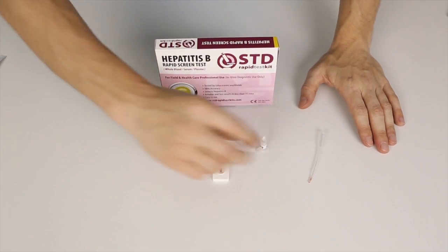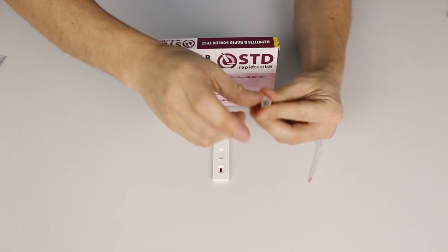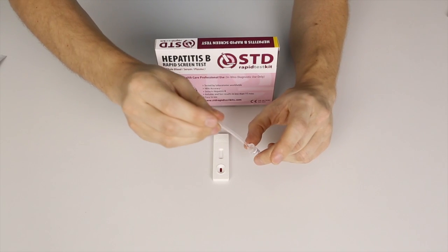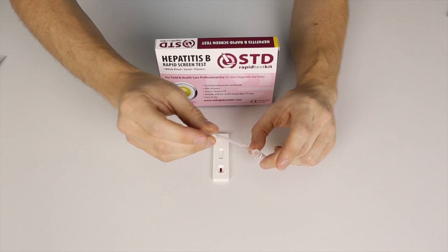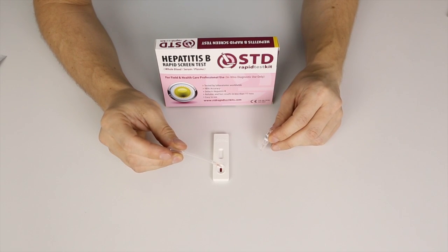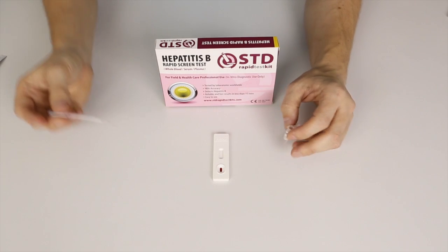What you need now is two drops of dilution liquid. Just twist the pink cap off. You place it in the sample well — it's the exact same place that we placed the blood. One drop. Two drops. And we're done.